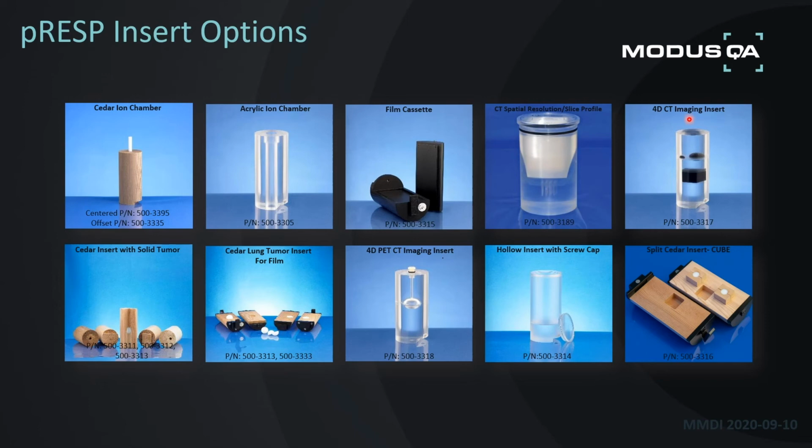This 4D CT imaging insert is useful to test for any motion artifact and also volume reconstruction. So there's different objects within it that you can verify that your treatment planning system is able to calculate those volumes correctly with any motion artifacts. We have a large array of cedar inserts where it's either drilled for an ion chamber, with or without a tumor, offset or centrally located. So there's quite a few varieties in that category.